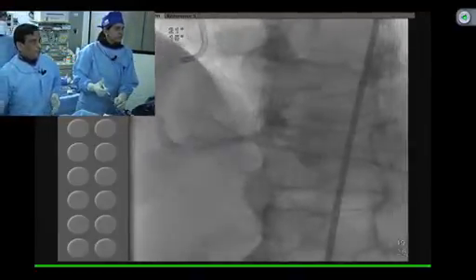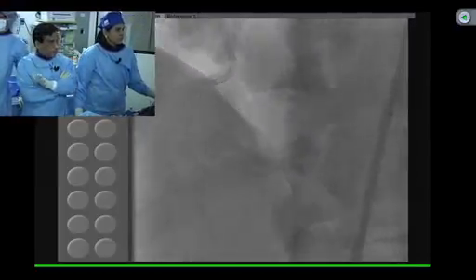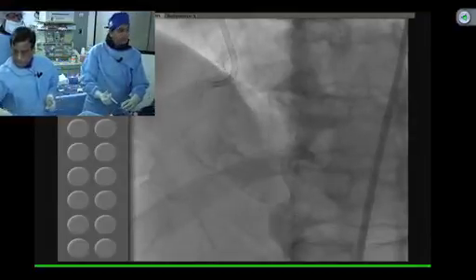I know we are about 5-10 minutes over, but if everything is good, we stop here. The goal was to keep one of the good branches. You want to go other? Yeah, little AP cranial maybe. Here we go. The distal branch bifurcation looks all right.